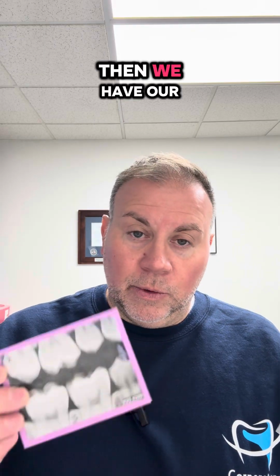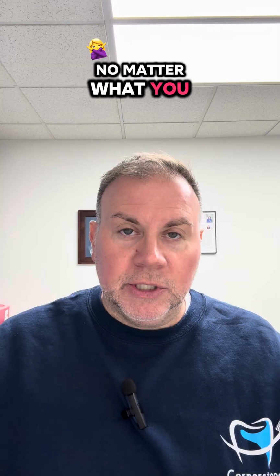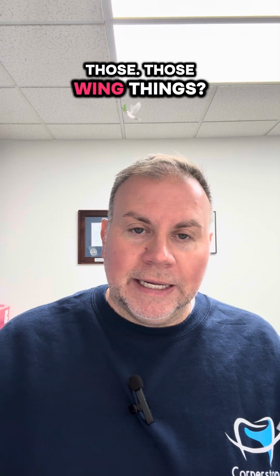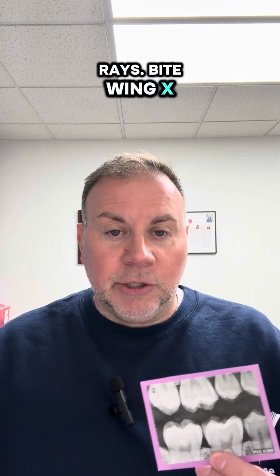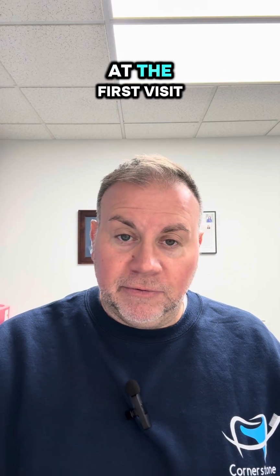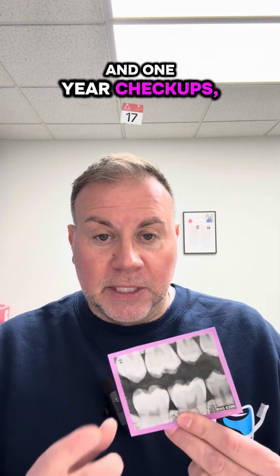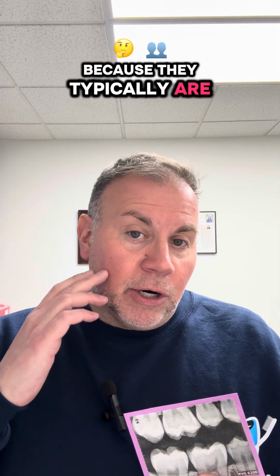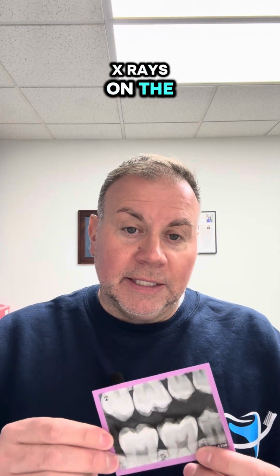Then we have our bite wing X-rays. These are the most common. No matter what you say, hey, I'm going to take an X-ray, "Oh, you mean those wing things, those wing X-rays?" Yes, the bite wing X-rays. Bite wing X-rays are some of the most commonly taken X-rays because whether they're taken at the first visit or whether you're coming in for 6 month and 1 year checkups, they're great because they typically are two or four total X-rays on the side of your mouth.